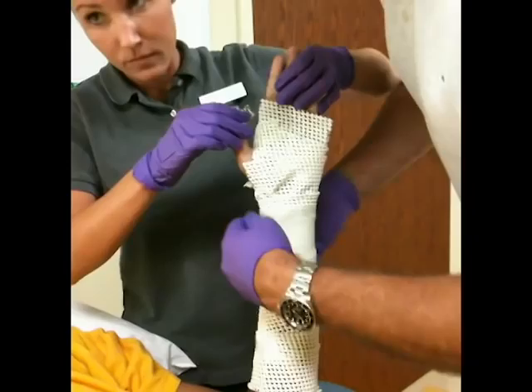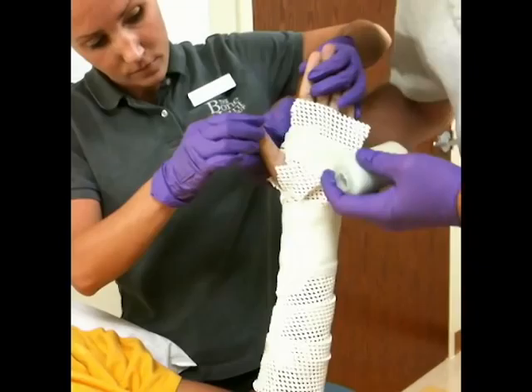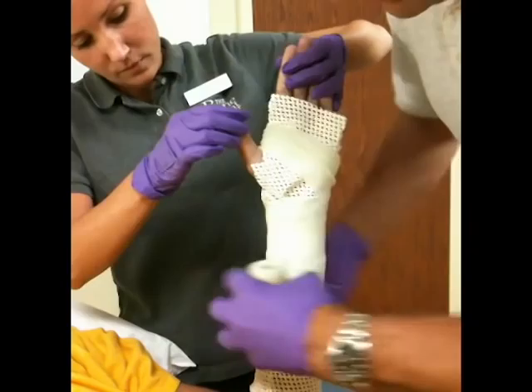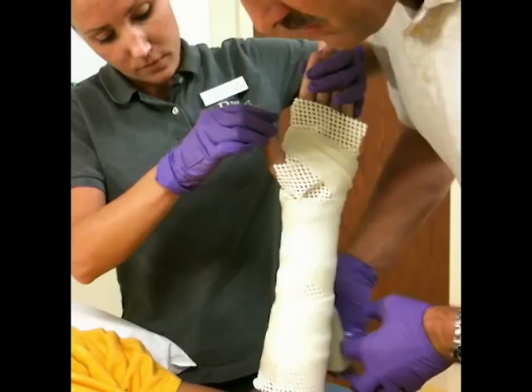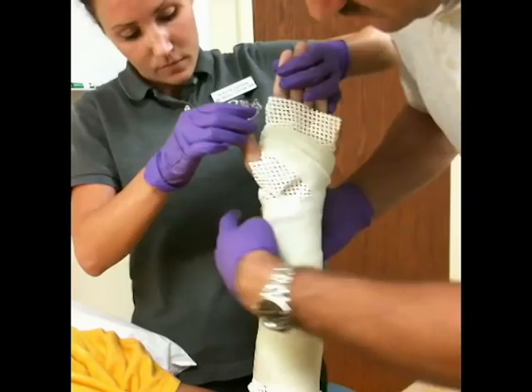The first layer of fiberglass is applied, making sure the fiberglass is not placed too tightly. You don't want the cast to be uncomfortable.